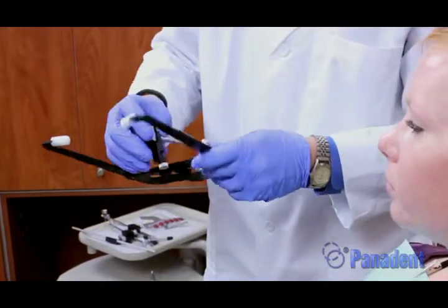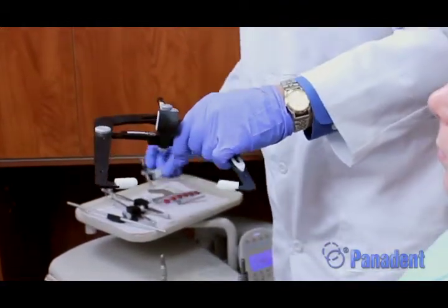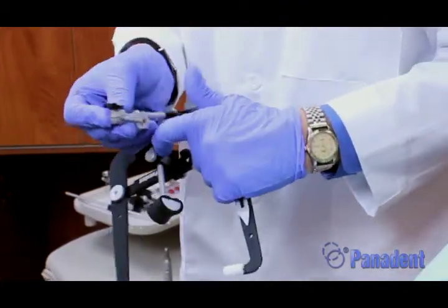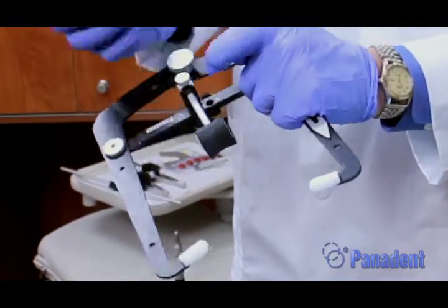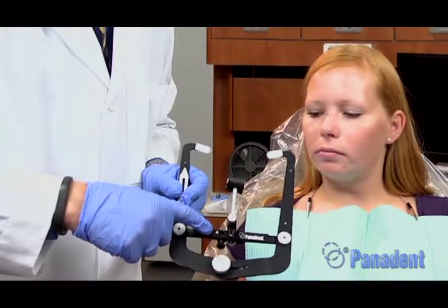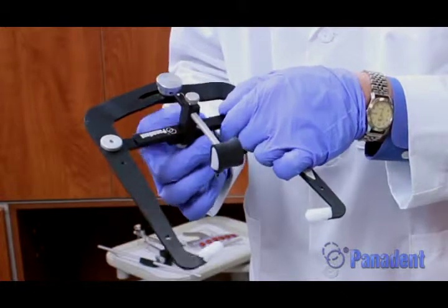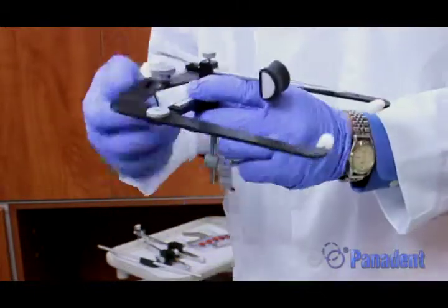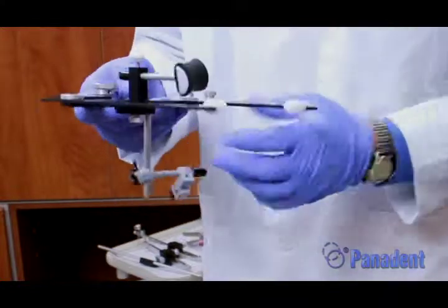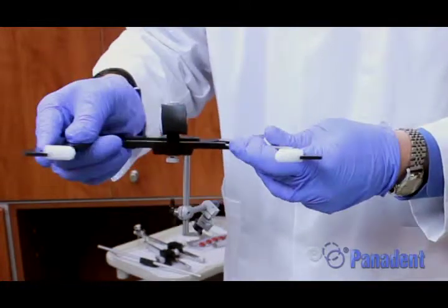To do that we start off by doing a traditional ear bow. We put the nasion relator in the upward position and tighten it in place. We do have the stem assembly which has a shorter end versus a longer end. The shorter end has a little 'A' on top which correlates with the 'A' on the face bow. So all you have to do is connect A with A and it'll put the stem assembly in the right position. We want to make sure our clamps are loose and ready. Push the nasion back and we're ready with our face bow.